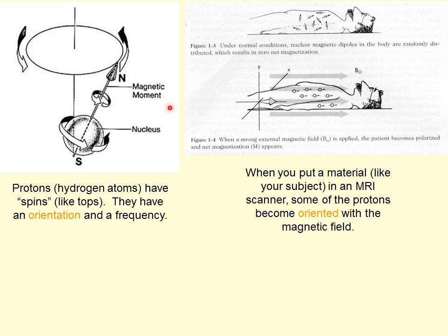And in this diagram here on the left, the orientation of the proton is this angle that I'm highlighting here with the red pointer. Okay, so if it had a bigger angle down there, it would have a different orientation, right?